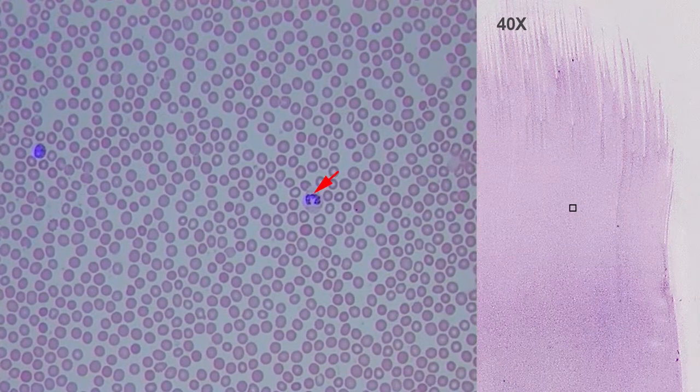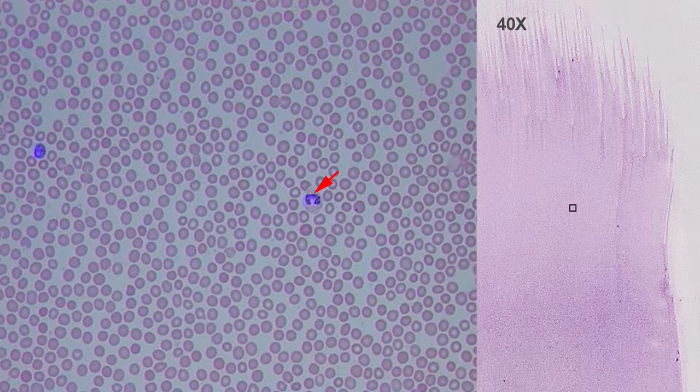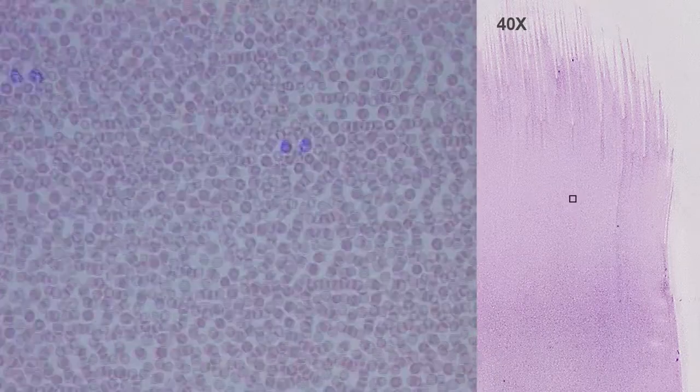Monocytes are the largest type of leukocyte. They contain kidney-shaped lobed nuclei, and these cells are able to migrate to tissues where they will differentiate into tissue macrophages when needed.